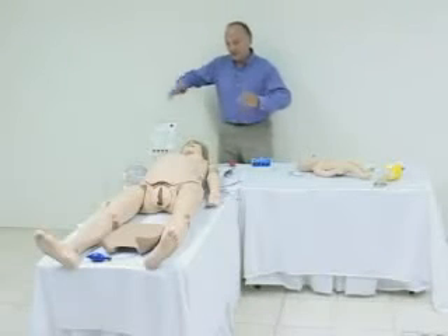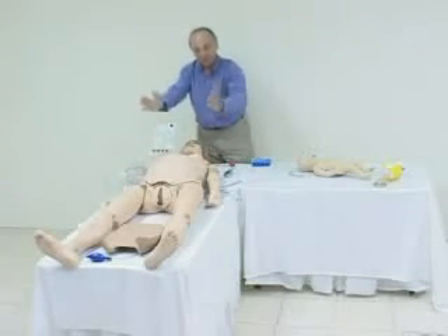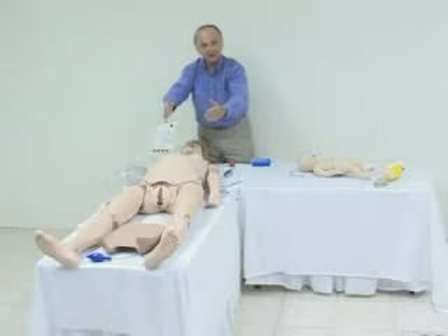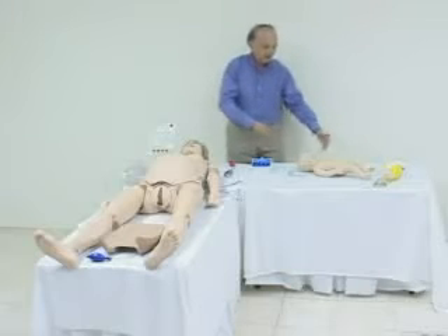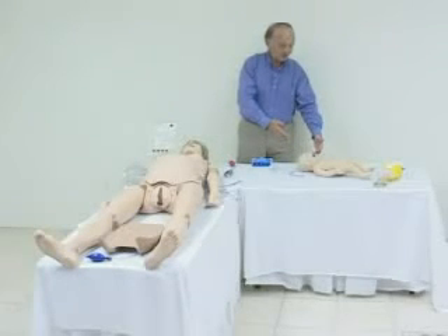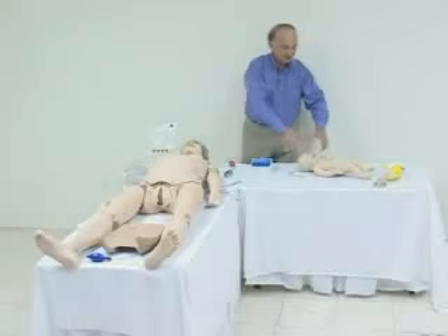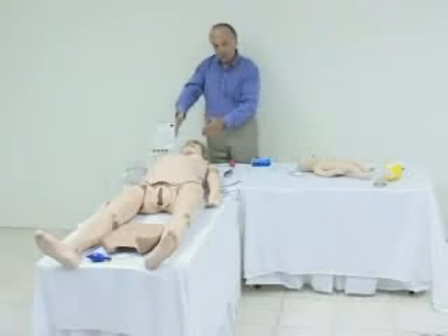The 550 consists of the full-size female mannequin with the birthing fetus. The fetus delivers automatically, and the 550 includes a neonate. The neonate can be intubated orally or nasally. You can do CPR, BVM, and UMBI.